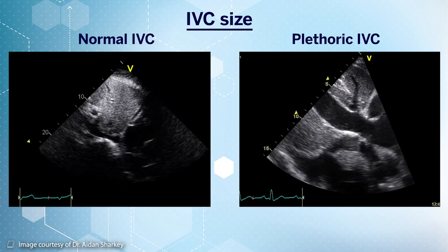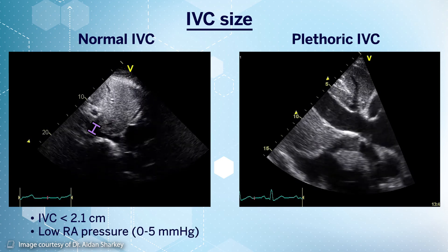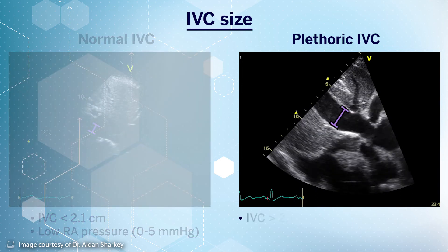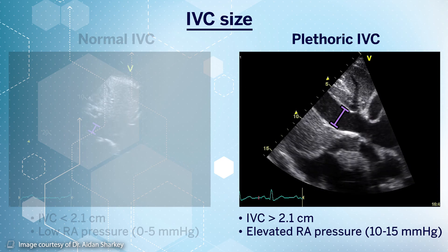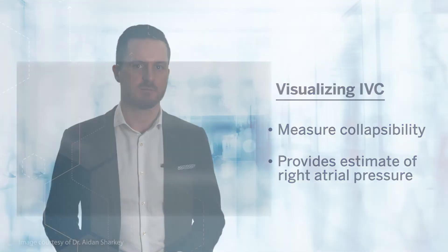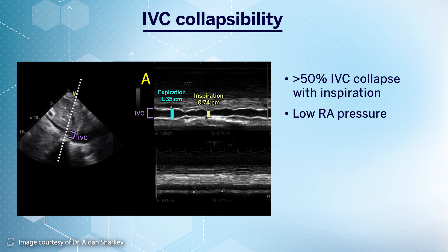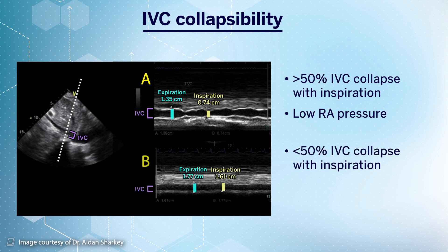When looking at the inferior vena cava, one aspect we evaluate is its size. The normal IVC diameter in spontaneously breathing patients is less than 2.1 centimeters, which indicates low right atrial pressures and suggests the patient would tolerate intravenous fluid administration, as seen in the video loop on the left. Conversely, an IVC diameter greater than 2.1 centimeters indicates elevated right atrial pressures, and this patient may not benefit from further fluid administration, as shown in the video loop on the right. We also examine IVC collapsibility throughout the respiratory cycle. In spontaneously breathing patients, greater than 50% collapsibility with inspiration as seen in image A suggests low right atrial pressure, whereas collapsibility of less than 50% as seen in image B suggests elevated right atrial pressures.